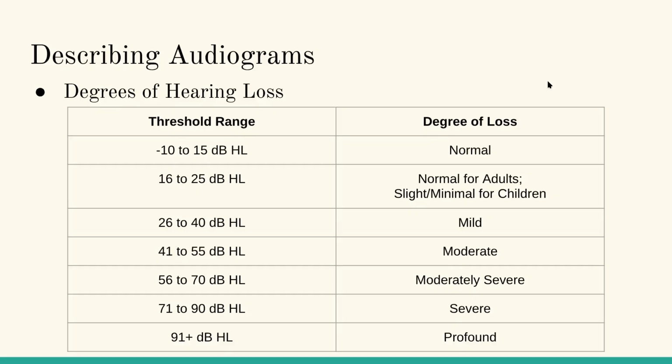They have a slight variation on it where they talk about it in the better hearing ear, and they use different categories, but they use a 4-frequency pure tone average to describe the loss. I'm an outlier in describing it that way. It's more common for people to say mild sloping to moderately severe, but I'm just not a fan of that method. I don't think it's as helpful.